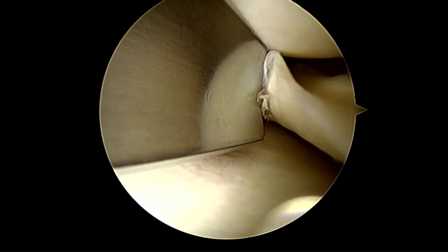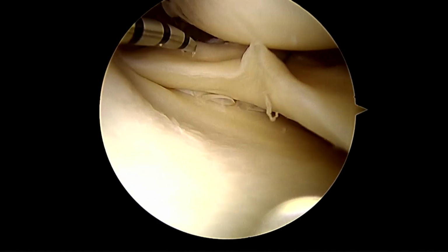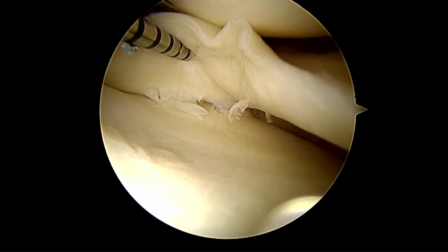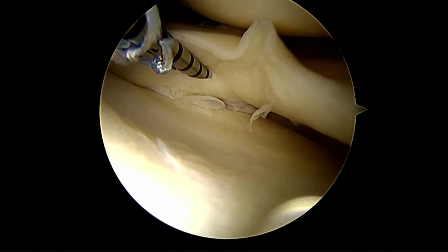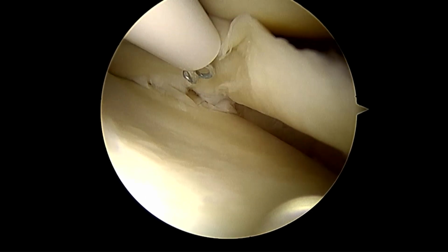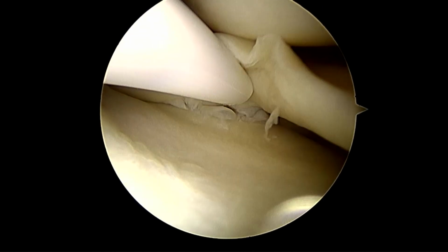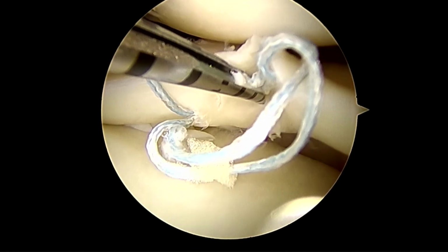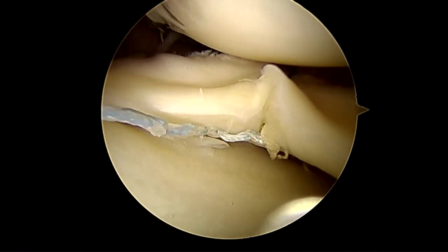After this, usually the ratio is 2. If we are taking 2 vertical mattress sutures, there has to be a minimum of 1 mattress suture on the inferior portion of the meniscus, so the ratio has to be 2 superior sutures to 1 inferior suture. And if we can take a horizontal mattress as well, if we have 3 vertical sutures, 1 here, 1 there and 1 here, we can take in between 1 horizontal mattress suture on the inferior portion of the meniscus, so that it gets compressed there. Good compression of the inferior part also, as well as this elevated part of the meniscus will settle down.